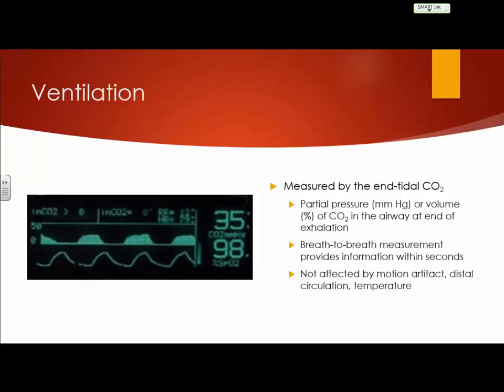Another issue that you run into is that the ET tube is very, very malleable and very, very slippery, right? And so we want to secure it in, but now we're attaching another cord to it that we're going to have to monitor very well because it could easily pull it out. Does that make sense?